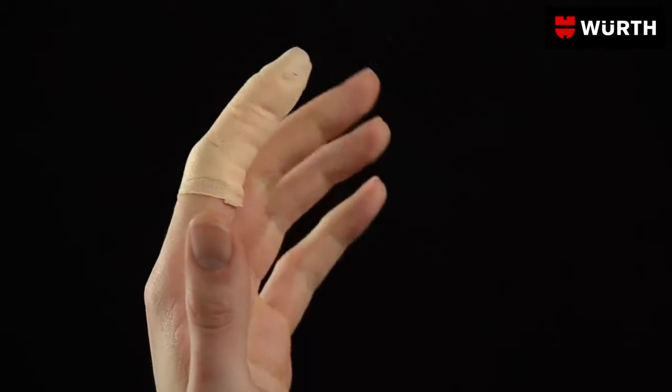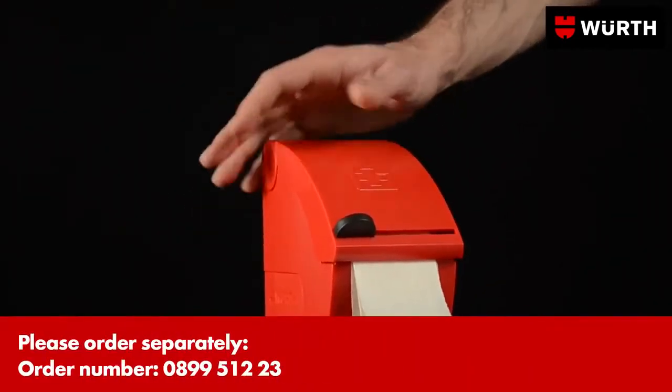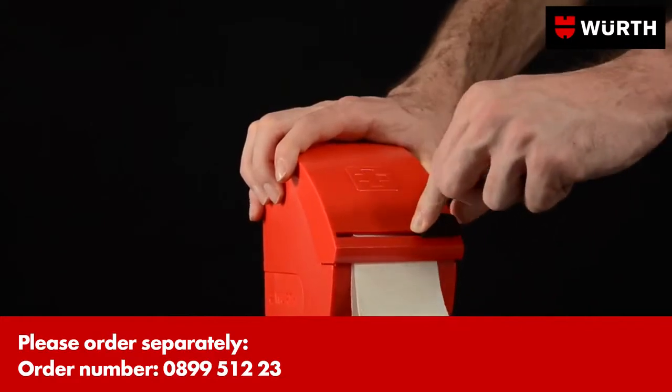Mobility is hardly affected thanks to the plaster's high elasticity. The optional dispenser allows an optimal length of plaster to be dispensed.